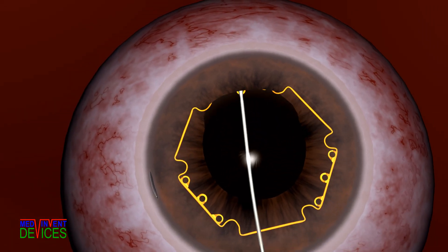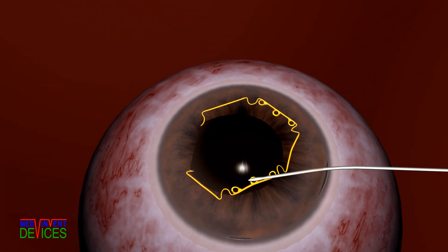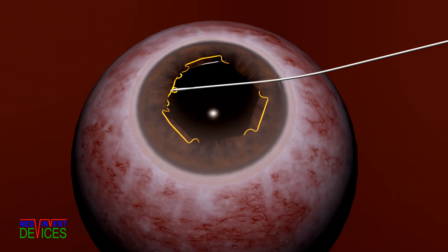Alternate flanges are tucked under the iris using the main and side port incisions. As the flanges are tucked, the notches engage the pupil margin, resulting in an expanded pupil.